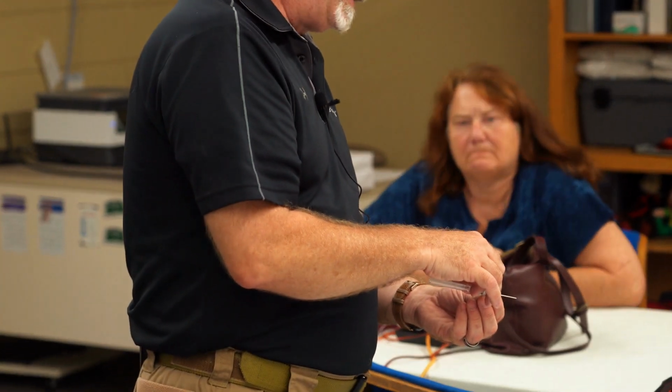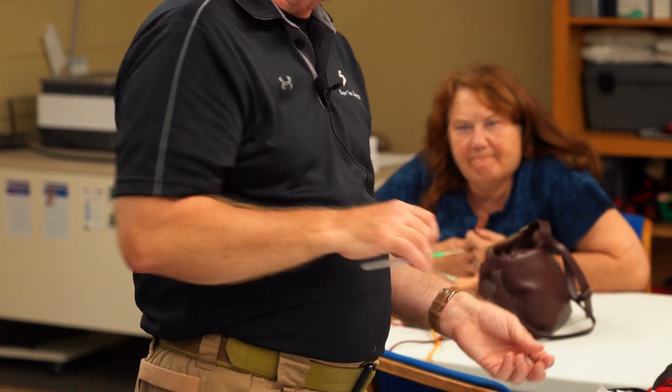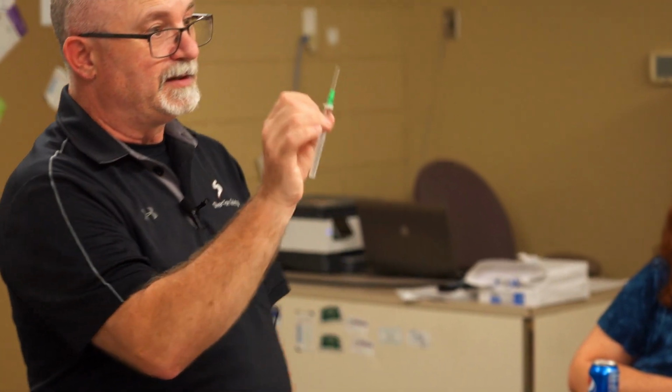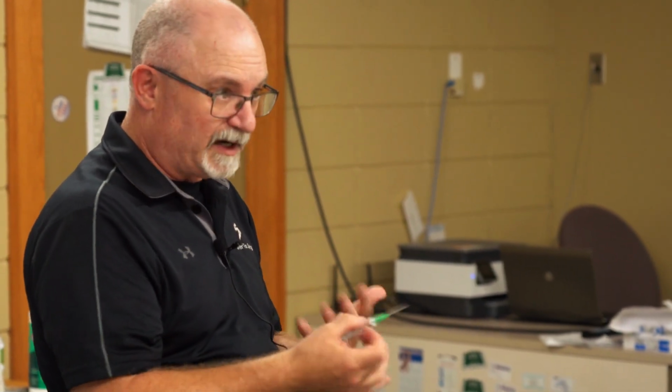If you start to advance the catheter and you change your mind, don't pull back, you have to withdraw everything. Because the concern is if we try and pull it back, there's a small chance that that straw might bend just enough and the bevel might cut off a small piece of the plastic, and now we have a piece of plastic floating around that could become an embolism. So it's called catheter shear. If you start to advance, do not pull the catheter itself back. Once you've started to advance, it has to stay there or continue to go, or you have to stop the whole thing, withdraw everything and start over. Because you can cut off a piece of plastic and stroke them out, or cause a PE or whatever else. That's the concern. It doesn't happen very often, but it is a real risk.